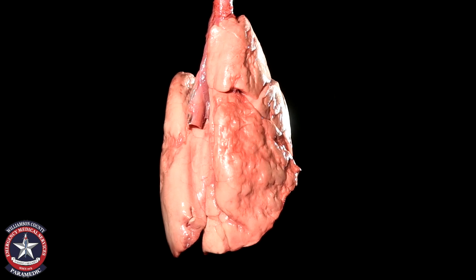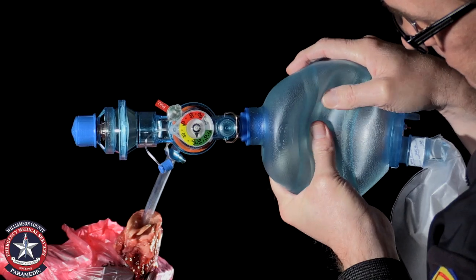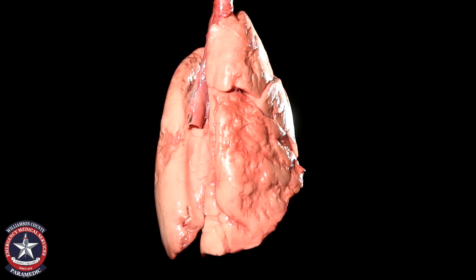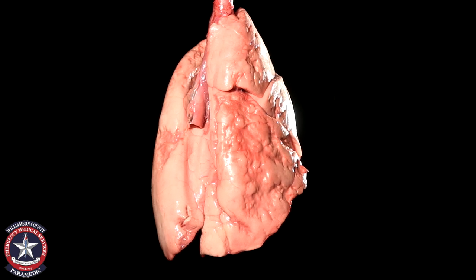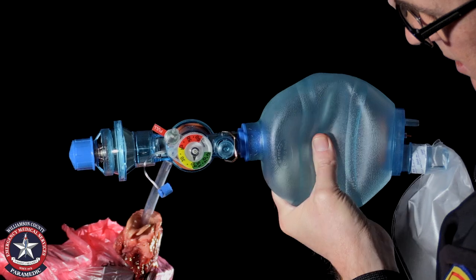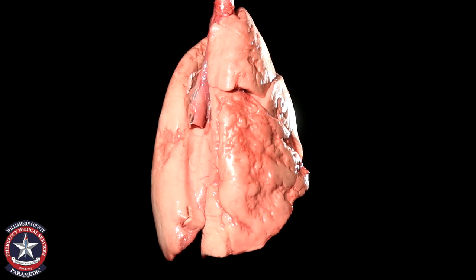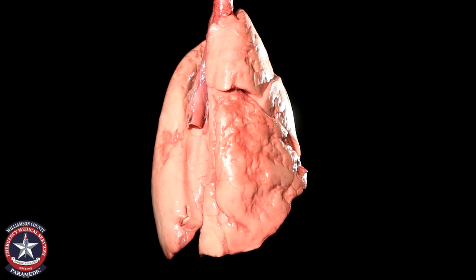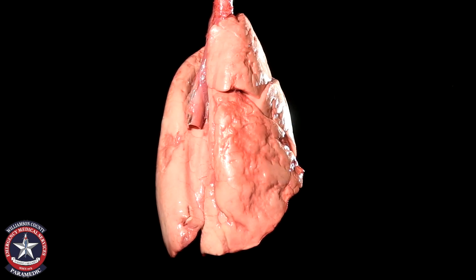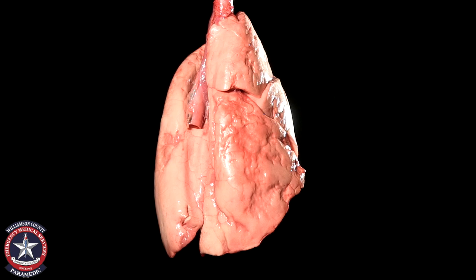Please note: I realize I'm ventilating way too fast — that is for demonstration purposes. I am truly not worried about changes in intrathoracic pressure and cardiac output in this model. I'm going to continue to ventilate here until we get a really good picture of a completely expanded lung. Notice in particular where there was a lot of collapse — this is now completely expanded and inflated, and we are seeing some good-looking lung right there.